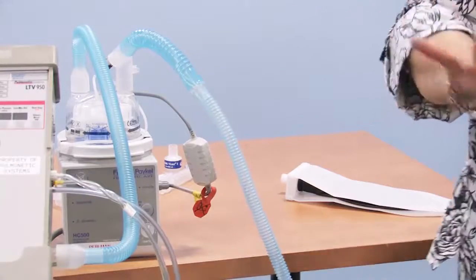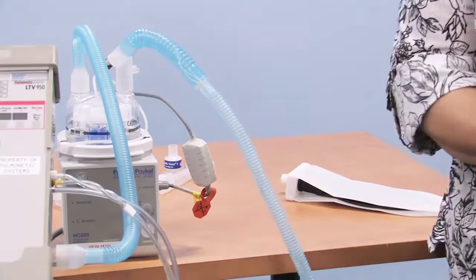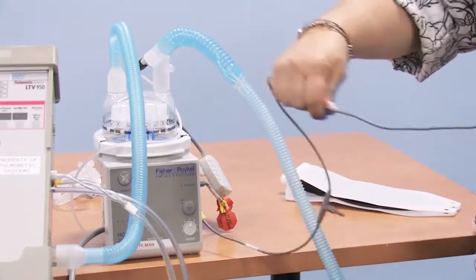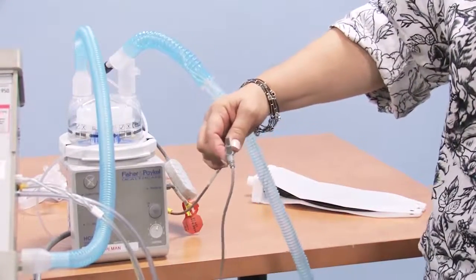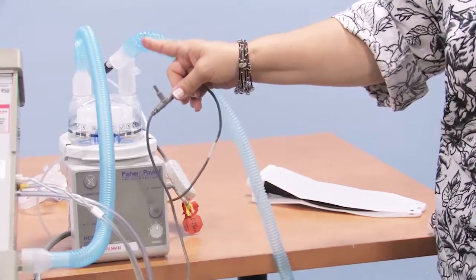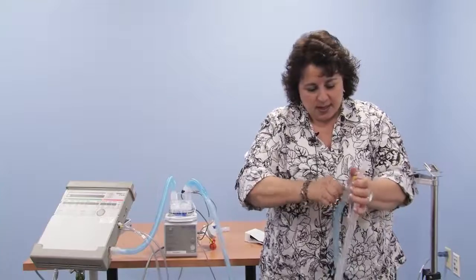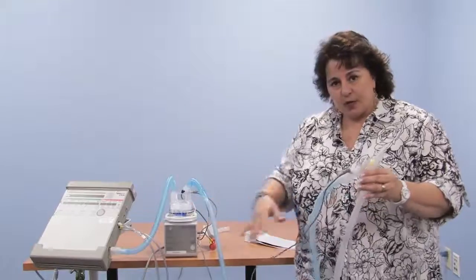In addition to that, we need a temperature probe so that we can allow the machine to know what the temperature of the air is. So here we have a connector that says probe, and you'll see there are 2 points on this gray metal reusable hose. Don't throw it out. You can alcohol the tips before placing it in when you change your circuitry. The machine wants to look at the air temperature when it comes out of the machine and also up near your child's tracheostomy tube. So we'll place one end here and one end here. And the circuit comes with this size adapter for these temperature probes, regardless of the brand of humidifier.